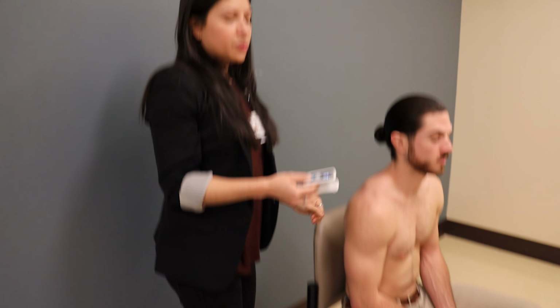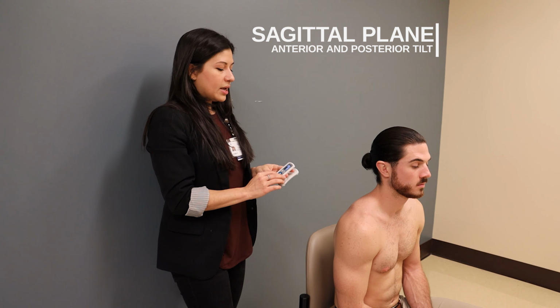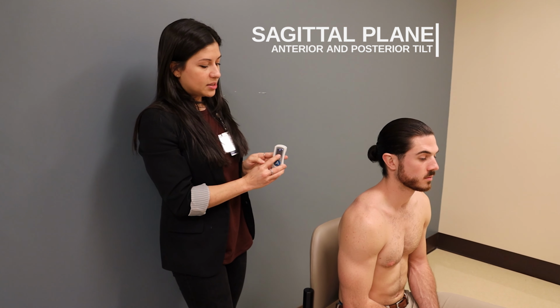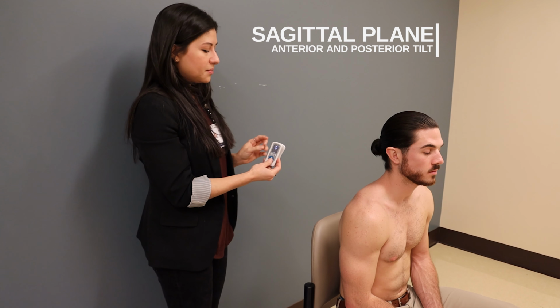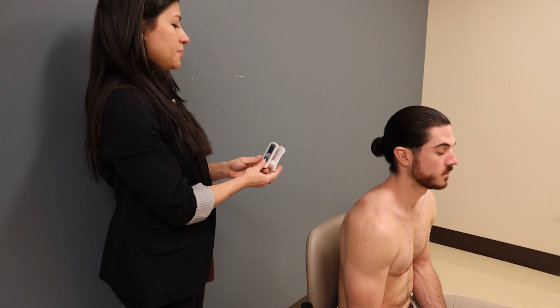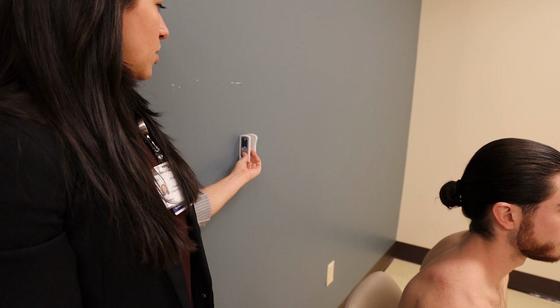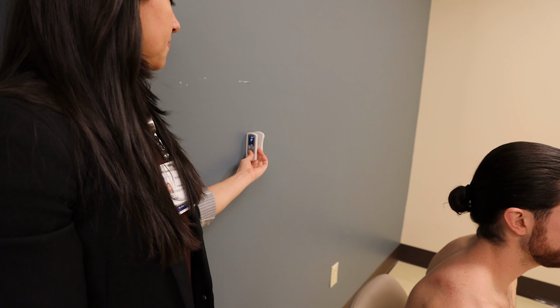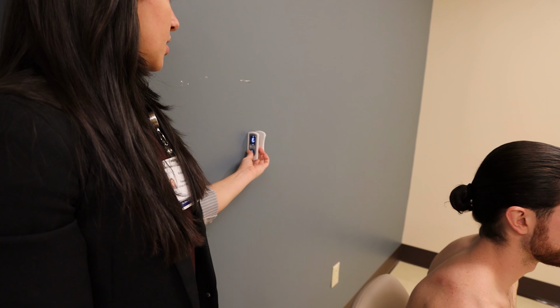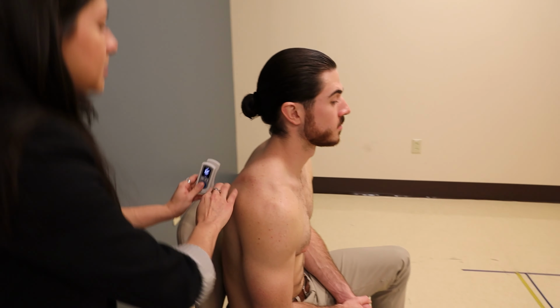So now we're gonna do the sagittal plane. So that's for anterior posterior tilt. And we wanna make sure again that the Easyangle is back to 0 and blinking. So it's ready to calibrate. We're gonna use the wall as our base for 0 and our starting point. So when we're ready and we have it against the wall just like this in a vertical position, we'll click the 0 and we'll come to the medial border of the scapula.